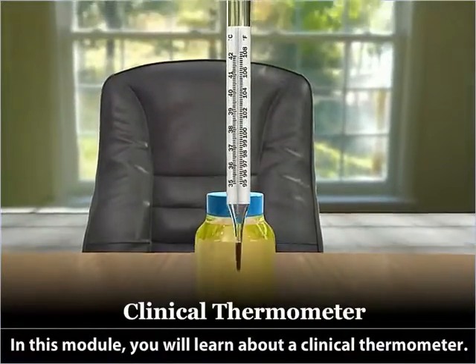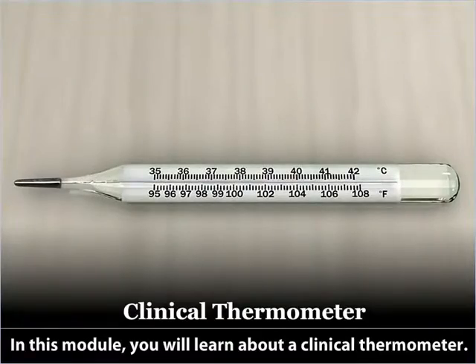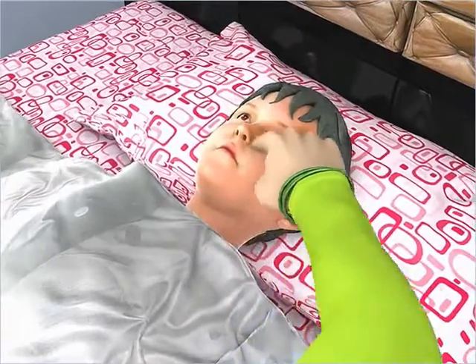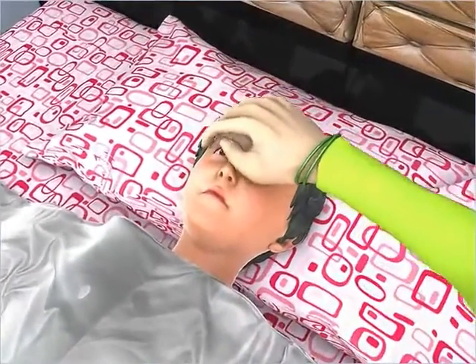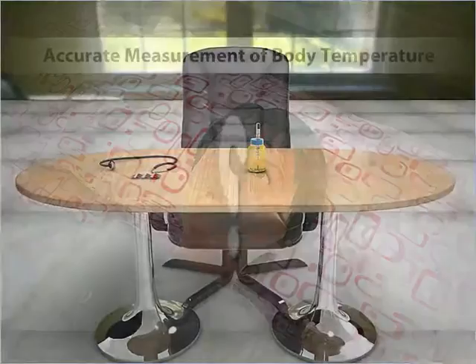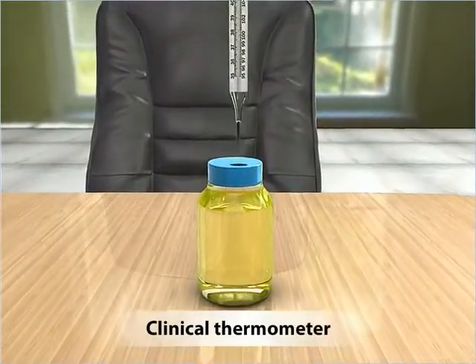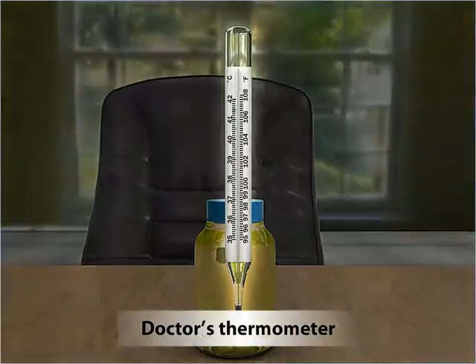In this module, you will learn about a clinical thermometer. Your forehead feels warm and you immediately suspect a fever. To be sure, however, you need to measure your exact body temperature. How would you do that? Well, with the help of a clinical thermometer, also called a doctor's thermometer.